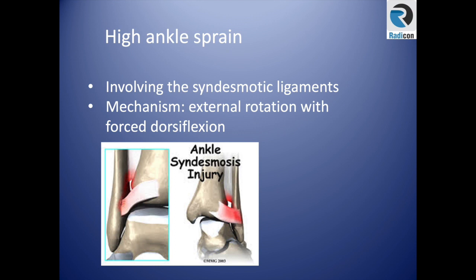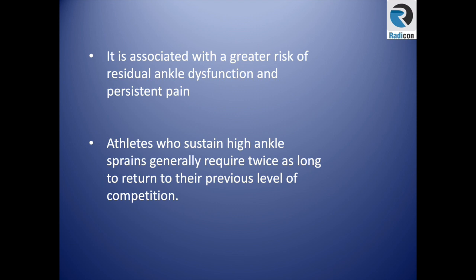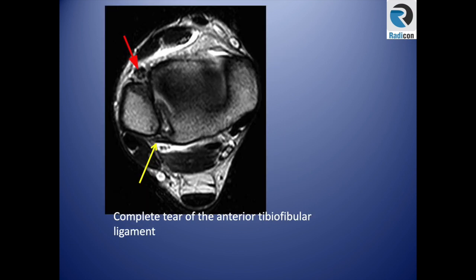The syndesmotic ligament is very important to recognize because it is associated with a greater risk of residual ankle dysfunction and takes longer to return to the field for athletes. On axial imaging at the level of the D-shaped fibula, you are at the syndesmotic level. Here there is complete disruption of the anterior tibiofibular ligament with a globular appearance of the retracted residual ligaments, indicating syndesmotic injury, while the posterior tibiofibular ligament is intact.